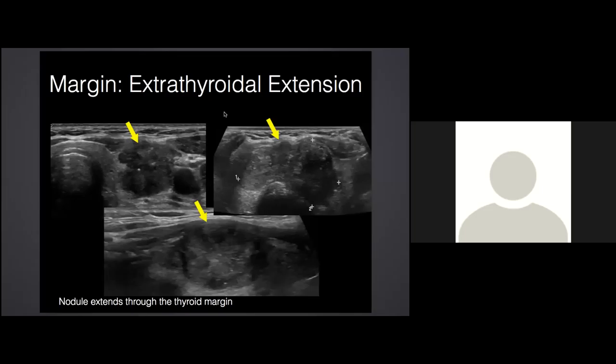And that is, I think, the other benefit of doing your own ultrasounds: you know your patient, you know his or her risks, as opposed to radiologists doing it, where, unfortunately, they don't have the background information of the patient's labs, family history, et cetera.